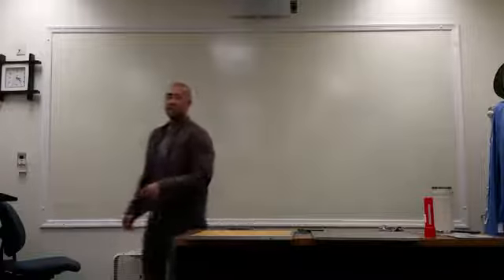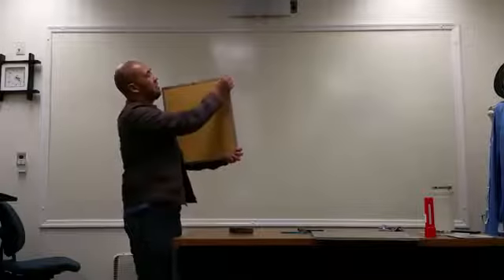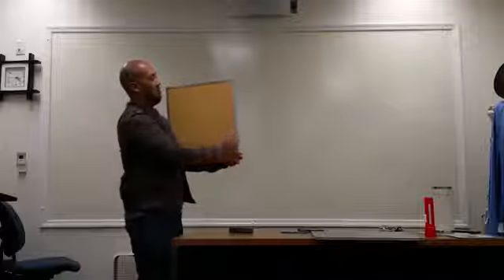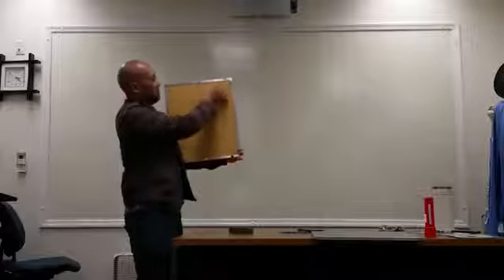All right, so the way these grids work is you have very thin strips within the construction of the grid, very fine leaded strips going down the length of this grid right here.